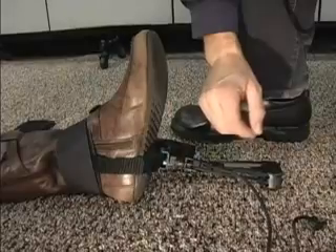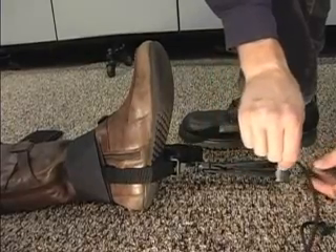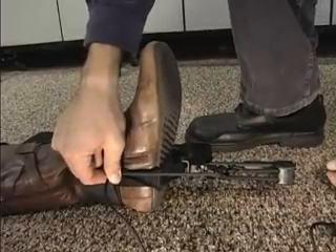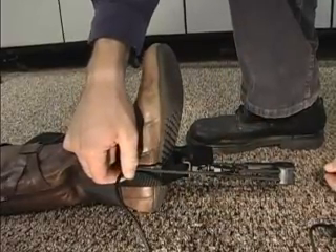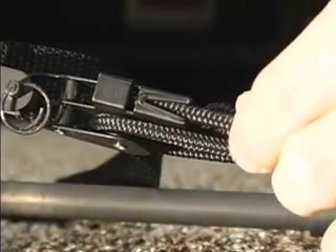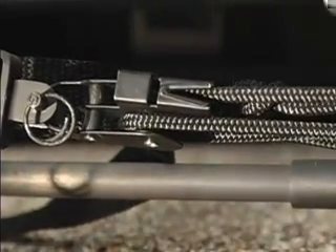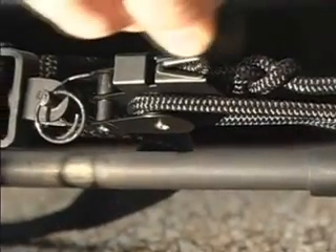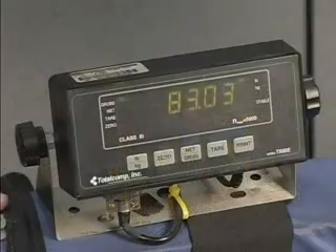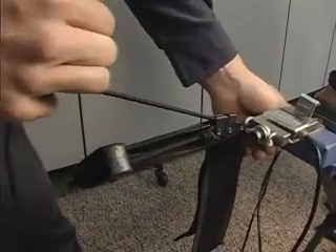At this time, a minimal amount of traction should be applied so that the splint is resting in its appropriate position. This is done by pulling the loose end of the line coming out of the black block and line mechanism below the patient's foot. To secure tension, lift the line up to the V-Jam cleat as tension is achieved. The V-Jam will hold the line secure. Please keep in mind that this is a very powerful device. For quality assurance, the CT6 is placed on a load sensor where it is pulled to 100 pounds of pressure and then left to rest at 60. This test ensures the splint strength and durability.